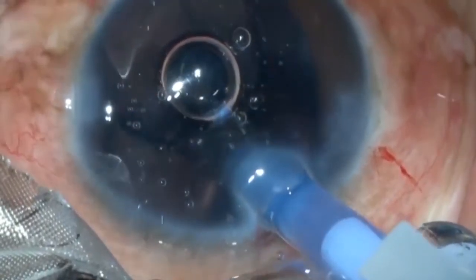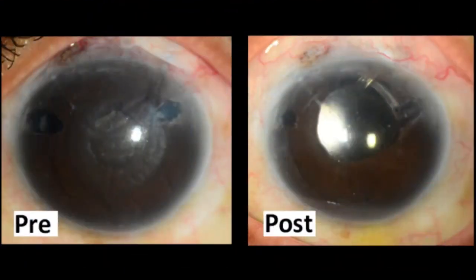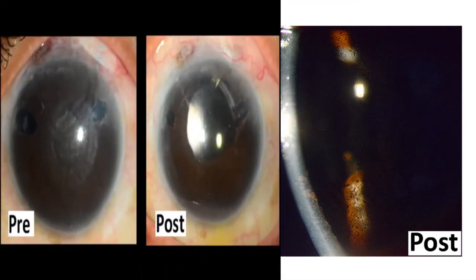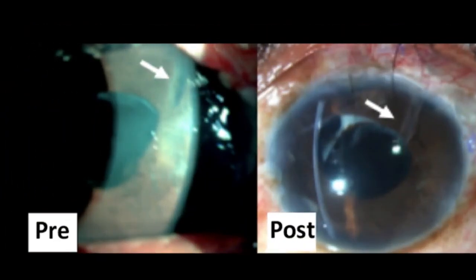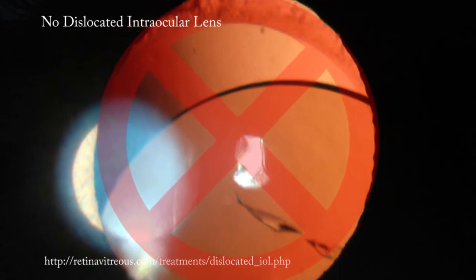All these were pseudophakic patients. If aqueous misdirection occurs in phakic eyes, then the lens has to be extracted first via the anterior route. We have not experienced any intraoperative or postoperative complications with the use of this technique, and it gives repeatable results, as seen here in several cases, with anterior chamber deepening peroperatively and staying deep in the postoperative period. None of the cases experienced a retinal break or detachment, nor was subluxation of the IOL seen.